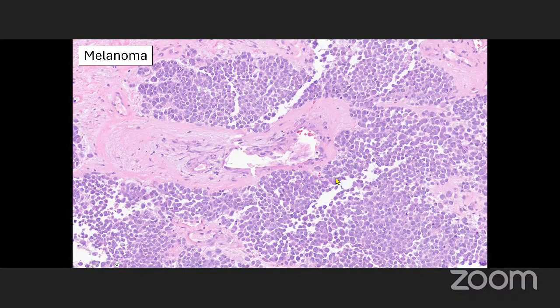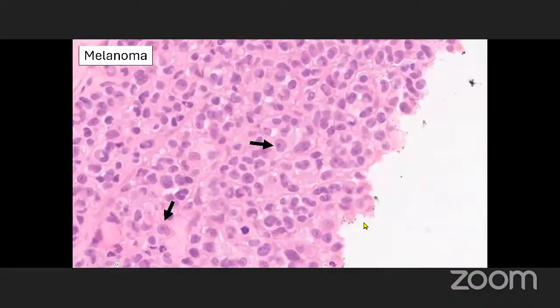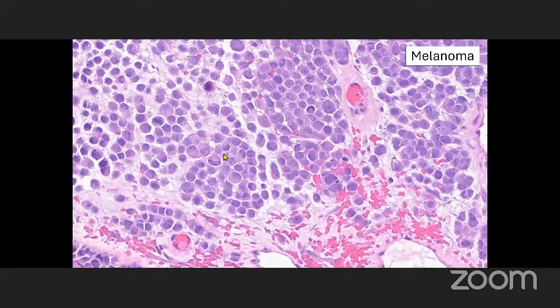They have a little more cytoplasm than you might see in alveolar rhabdomyosarcoma, and the chromatin may be a little bit more open here. If you get prominent nucleoli, vesicular chromatin, and really prominent, particularly cherry red nucleoli, that's a really good clue for melanoma. And the other thing is they love to get these rhabdoid cells, okay? So similar to what we've seen in some other tumors, but tend to be uglier rhabdoid cells, but there's certainly overlap. But you can see these kind of eccentric nuclei, prominent nucleoli.